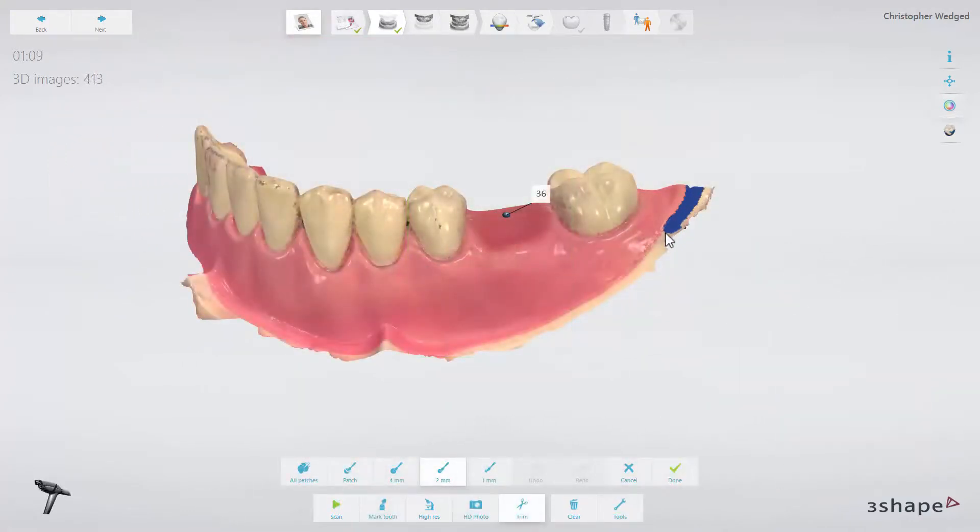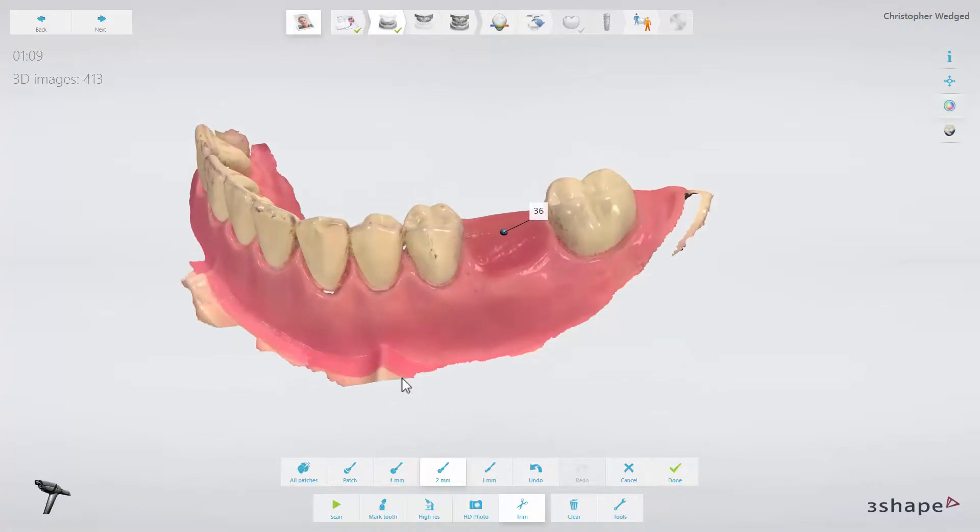When we now look at the digital model, we can see that we have about 15mm of surface that we can place the guide on. Remember to scan the quadrant, so you have the freedom to rest your guide on as many teeth as possible, to get the desired stability.